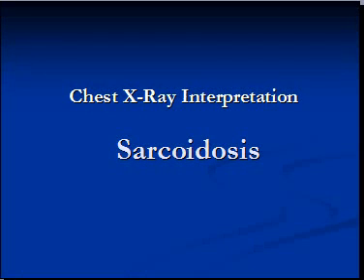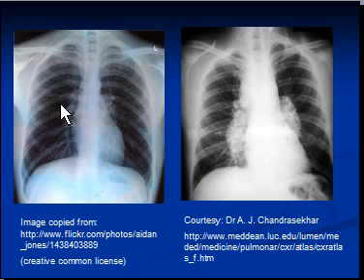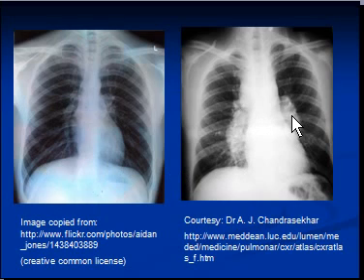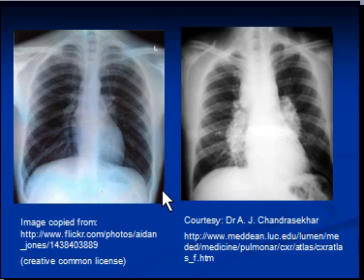We will continue to discuss sarcoidosis, especially the radiologic appearance on a chest X-ray. The chest X-ray on your left hand side is absolutely normal. The X-ray on your right hand side shows bilateral hilar masses, which is a classical representation of bilateral hilar lymphadenopathy. The X-ray also shows enlarged paratracheal lymph nodes.